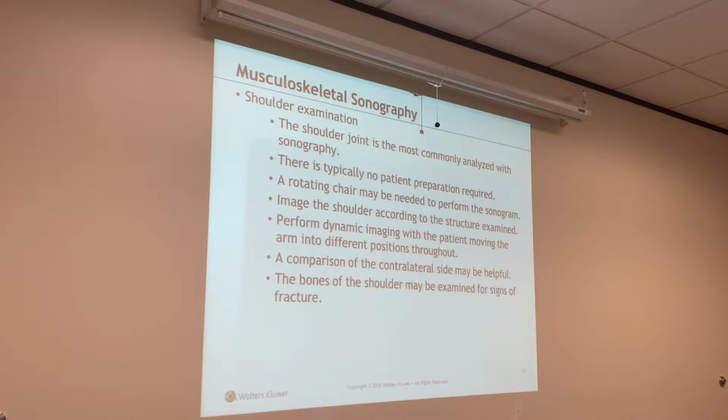For a shoulder, I'm gonna do internal rotation. I'm going to do external rotation. I'm going to do abduction, okay? And I'm going to do adduction. Okay, so that way you can see that shoulder muscle move in the different planes. Usually, MSK registered technologists usually work in an orthopedic office. Okay. Now, at Bentob and at LBJ, we will be rotating through fluoroscopy, and they have an ultrasound machine in there, but they do diagnostic. I mean, they do therapeutic exams because they inject cortisone.